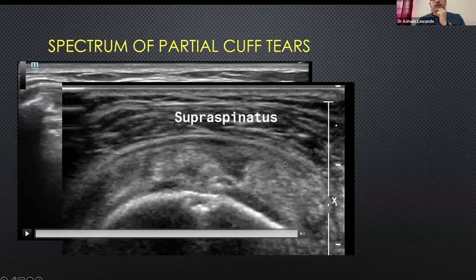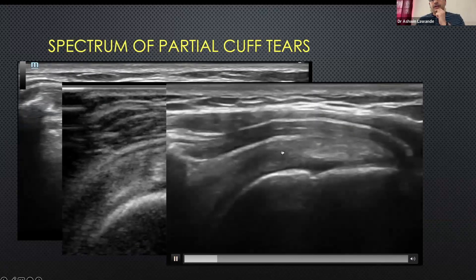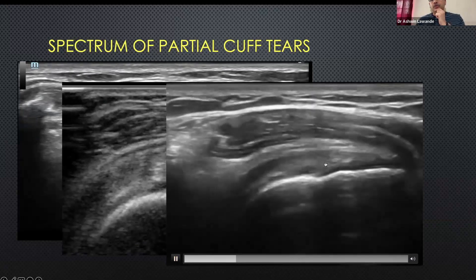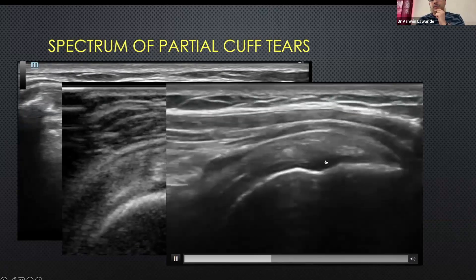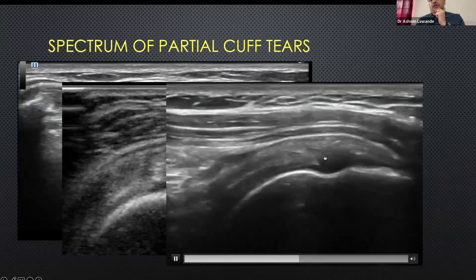Then you have the bursal surface tear — because this is the subdeltoid bursa — and it's high grade because it's involving almost two-thirds the thickness of the tendon. And then the last variety: can you see this thin hypoechoic line going into the substance from the footprint? This is the interstitial tear.